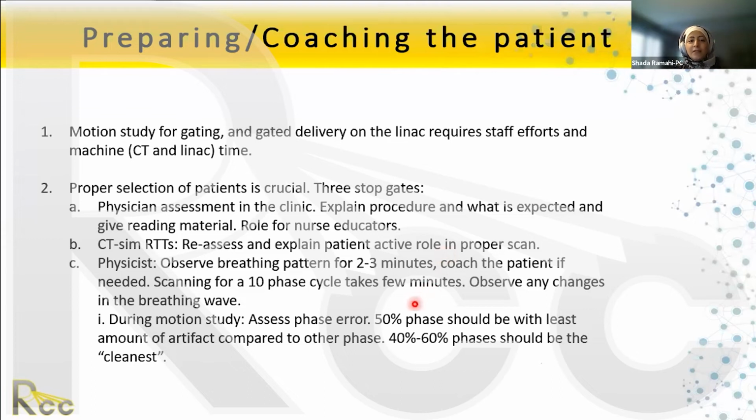So it does take a lot of time. You have to observe, you have to coach the patient, you have to train them, you have to observe them. And before we take the scan, you need to let them know that the couch is moving, because they've been sitting on the couch for 5-10 minutes and you're just looking at them, and all of a sudden the couch starts moving. They would freak out, right? So you should let them know in 1 minute, the couch will move. You're doing fine. Keep on doing what you're doing. And then, of course, after the CT scan, the physicists start the motion study.